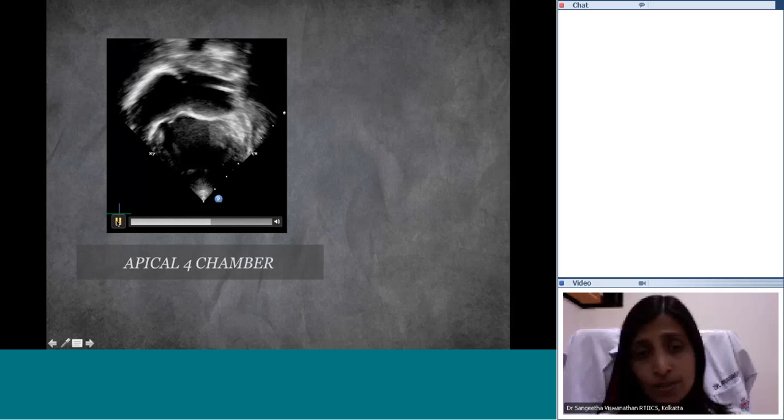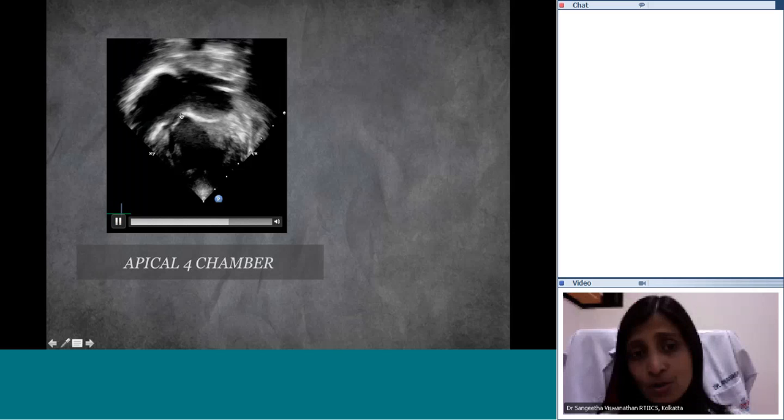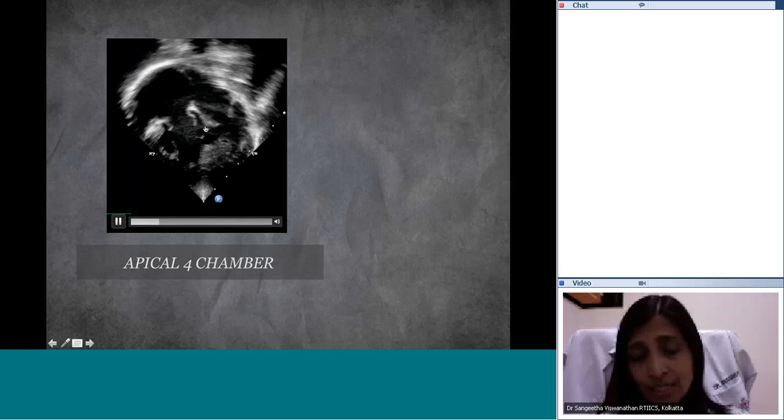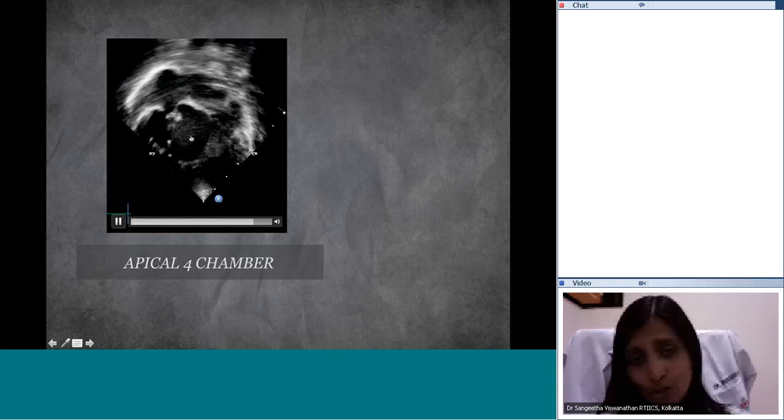So this is the patient with, you can see the apical 4-chamber view shows that there is no AV valve offsetting. There is a large VSD here in the inlet septum. You can see some tricuspid valve tissue reaching out to the crest of the septum.